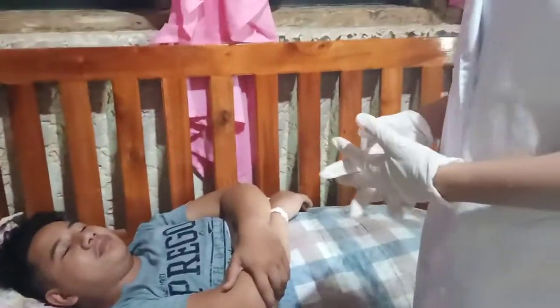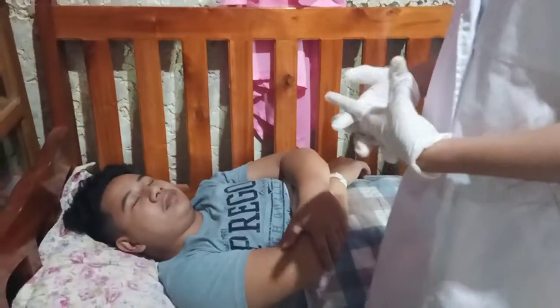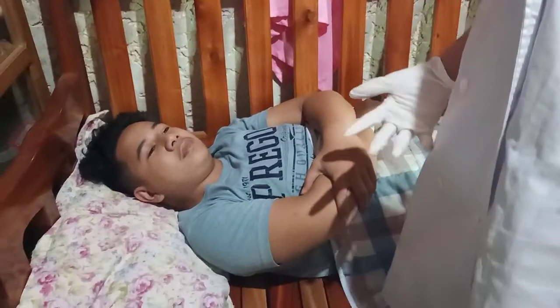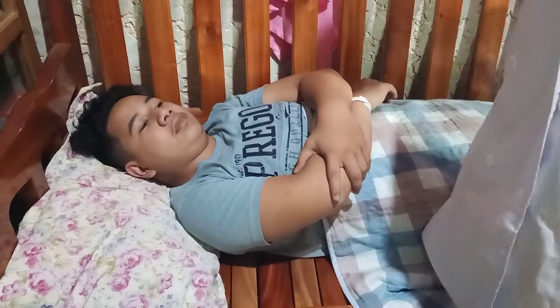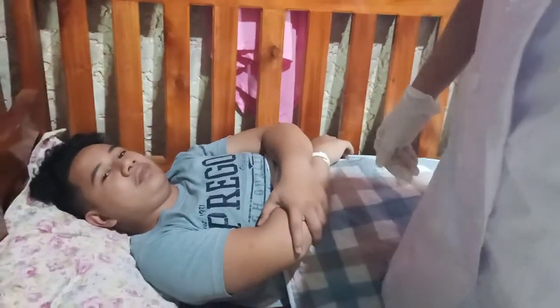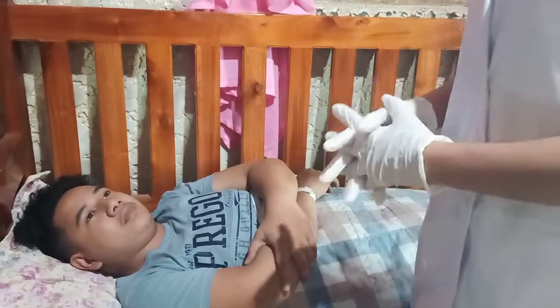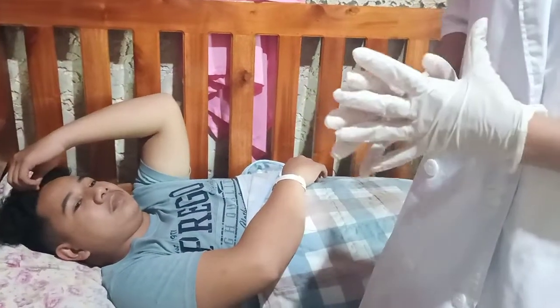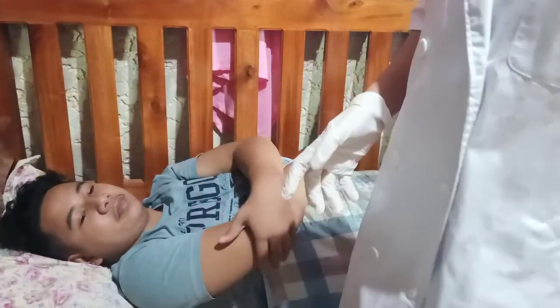So, sir, today, I'll be doing subcutaneous injection. I have to inject insulin in this part of your abdomen, sir. Is it okay? Yes, ma'am. So, insulin is to control your blood sugar, since you have type 1 diabetes. Will that be alright, sir? Yes, ma'am. Okay.